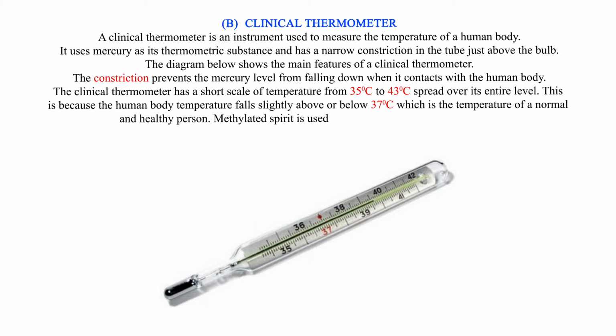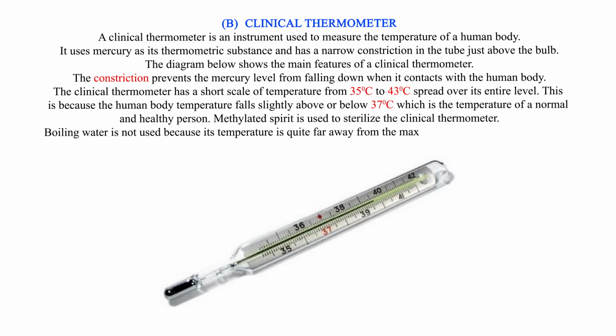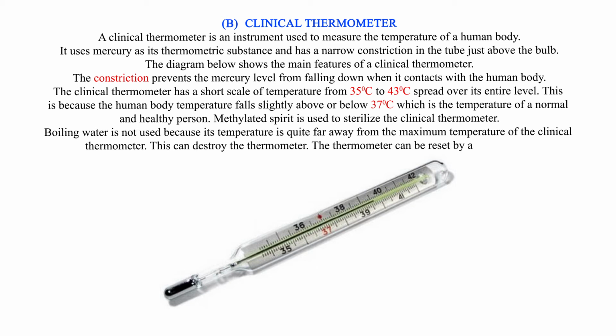Methylated spirit is used to sterilize the clinical thermometer. Boiling water is not used because its temperature is quite far away from the maximum temperature of the clinical thermometer. This can destroy the thermometer. The thermometer can be reset by a simple flick.